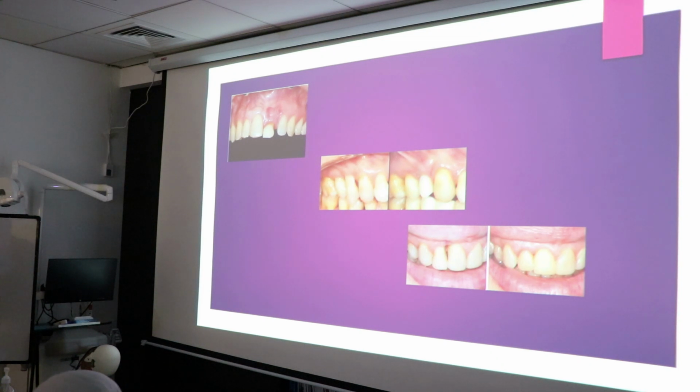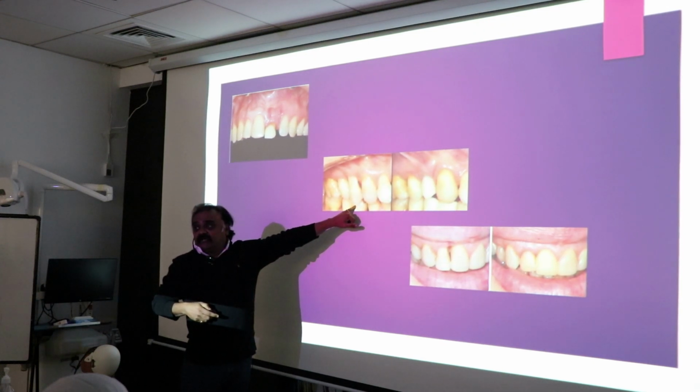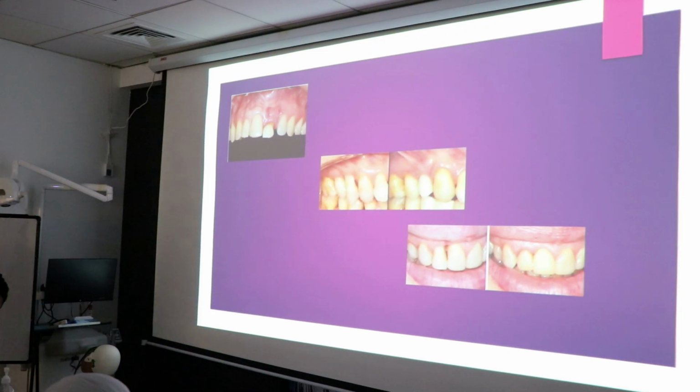Yeah, exactly. Thank you. And here when we have an angular bone defect, of course we brought about an extrusion here, but even when we have an angular defect nowadays, we are able to, and to answer your question about the labial amount of thickness to be achieved, we combine extrusive force of the tooth along with a buccal torque now. That is, we are torquing the root buccally here. So when the root is being torqued, you start to have bone formation there. But you will not get a thinner buccal bone when you are doing that.